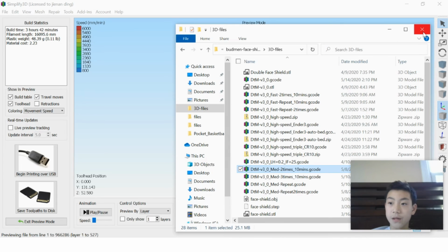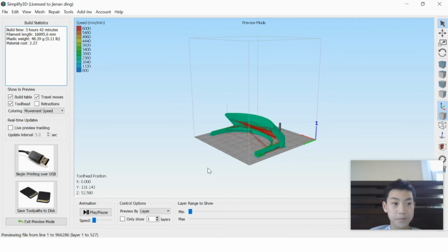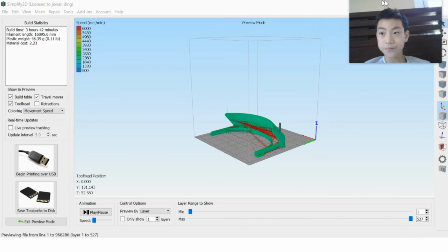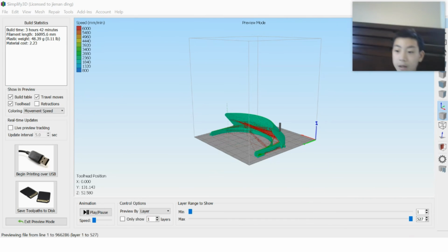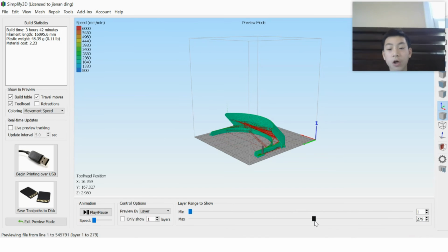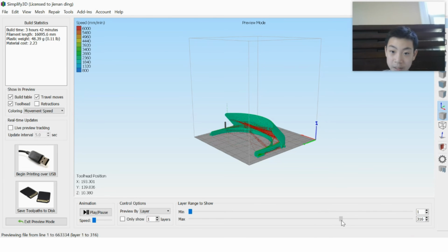Alright, so now you can close your file, and look. It still says 3 hours because that's for one. But if you go down and you go slowly, you can see that one print is only halfway. Since it won't show it pushing off because you can't really do that here, you will just see it's printing in the same place.